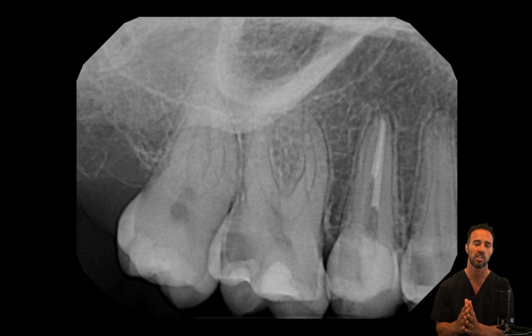Okay, so I hope you can appreciate how powerful this is. This procedure, once you get good at it and kind of get into a routine, oftentimes will take you less than a half an hour. I performed this procedure in about 22 minutes or so, and if you placed your definitive restoration in the tooth now, you will have had maybe 40 minutes of chair time and a very, very profitable procedure, and a patient who had all this done in a single visit as opposed to having to come back to the office multiple times or going across town to another provider. And it is just a great service you can provide for your patient.